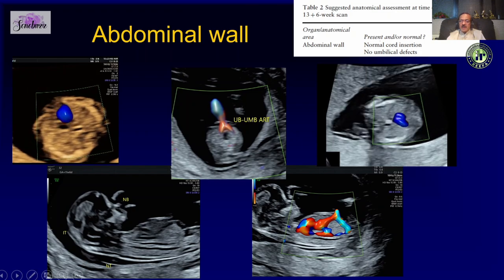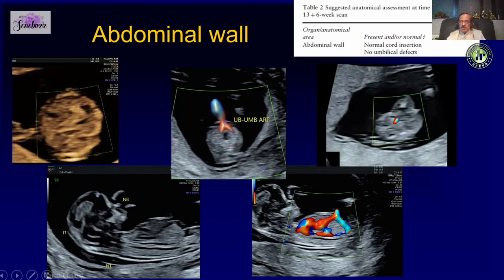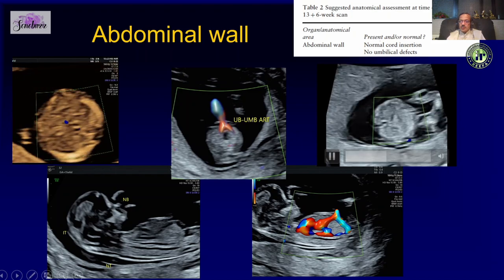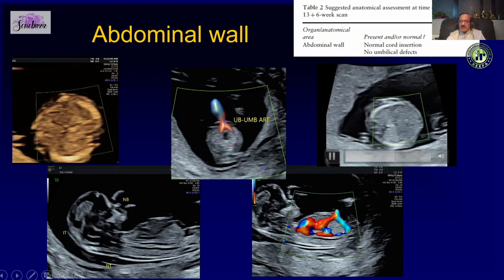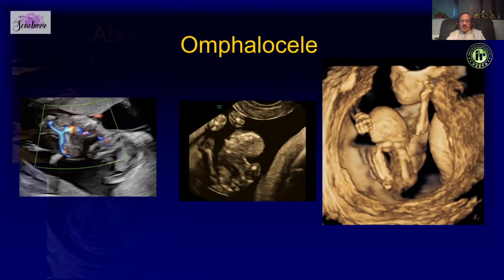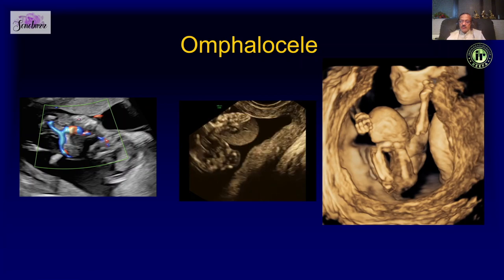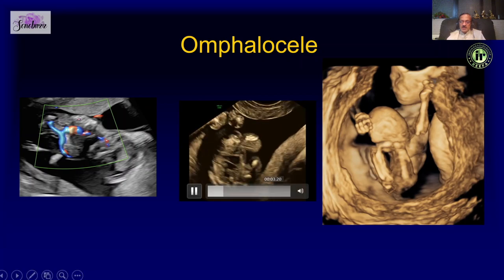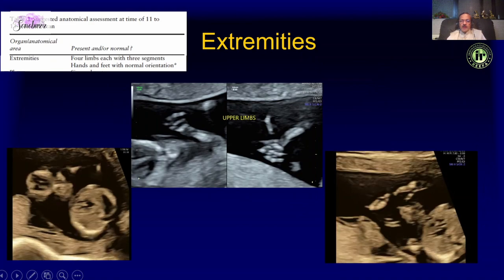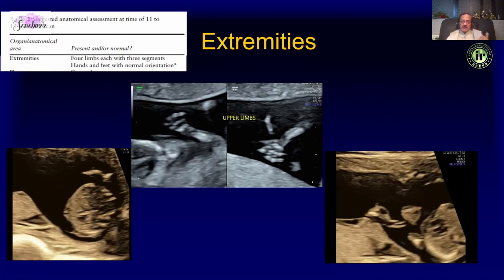The abdominal wall is very important — look at the contour of the fetus, make sure the abdominal wall is intact, and look at the cord insertion to pick up omphalocele. Make sure there are two umbilical arteries. The most common thing we see in the first trimester is omphalocele — this is the same fetus who also had a DORV.